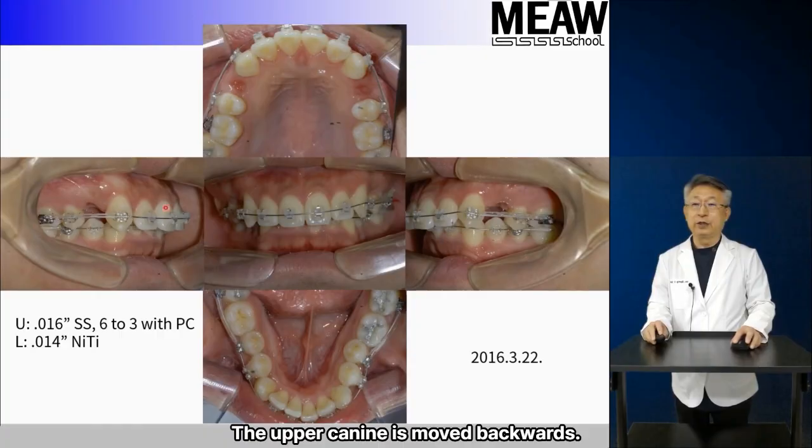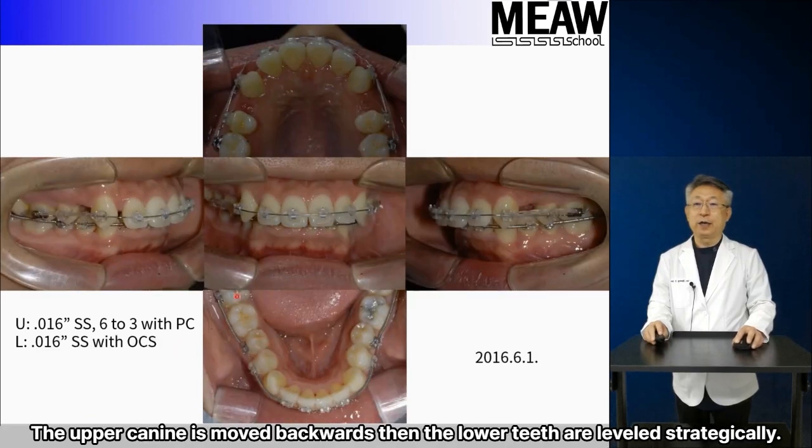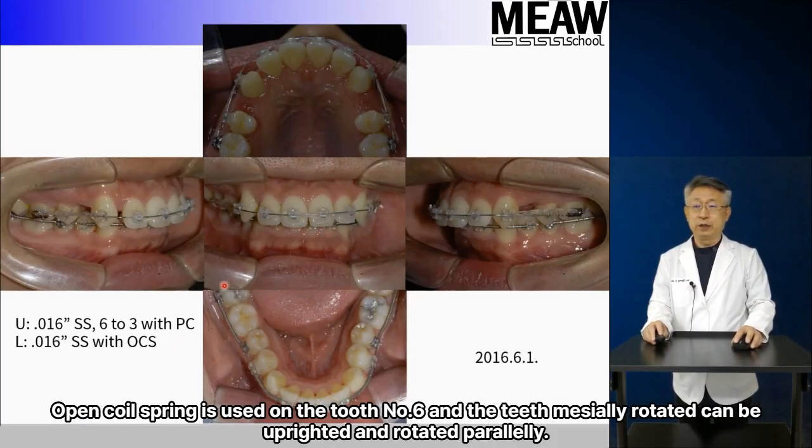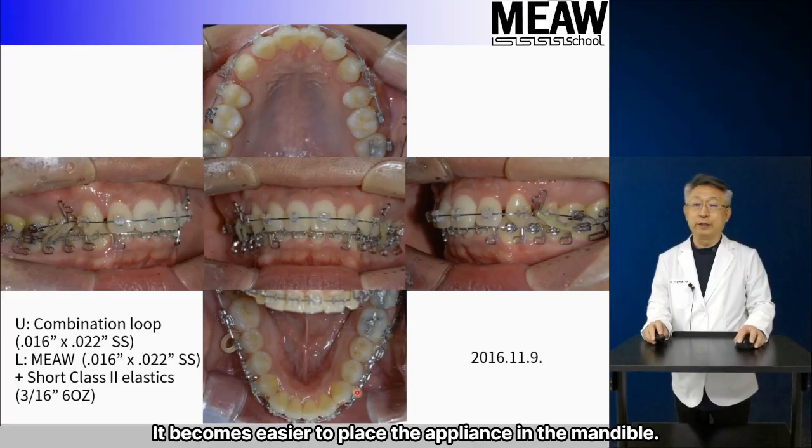The upper canine is moved backwards. Then, it is possible to place the bracket in a somewhat accurate position. The upper canine is moved backwards, then the lower teeth are leveled strategically. Open coil spring is used on the tooth number 6, and the teeth mesially rotated can be uprighted and rotated parallelly. It becomes easier to place the appliance in the mandible.